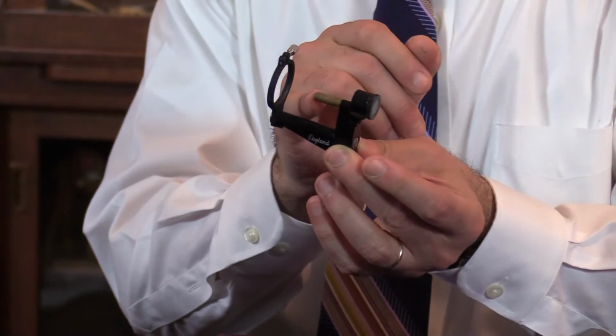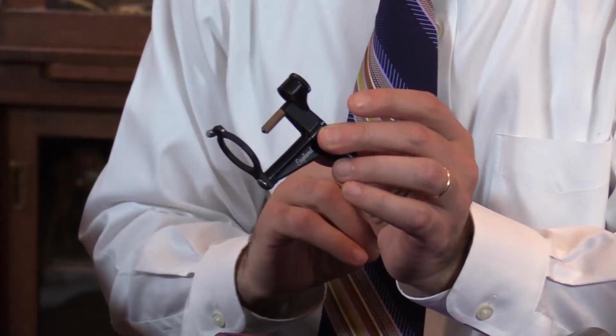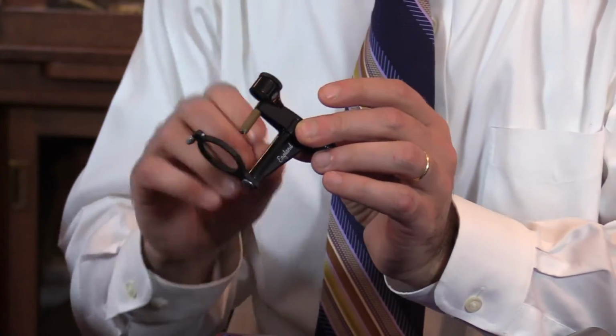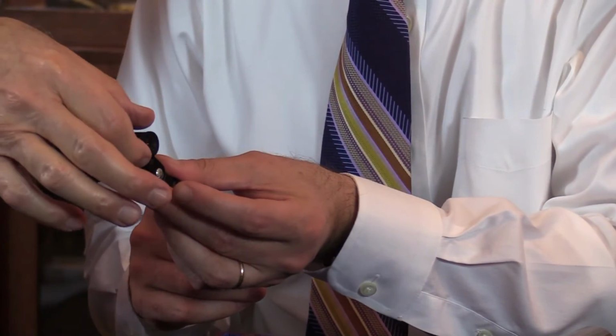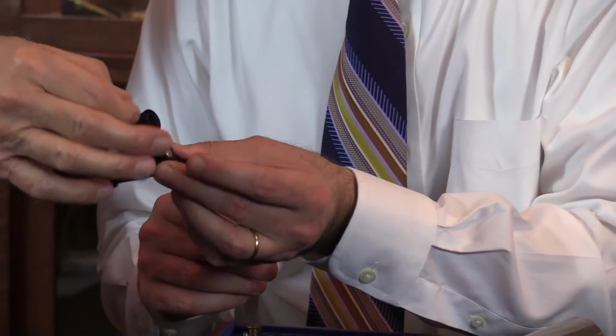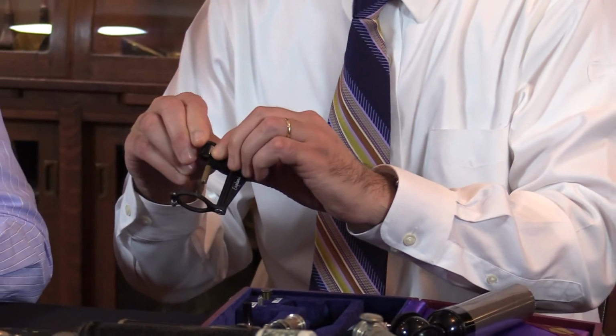And it's the bulb right here, and so we can use it to instrument the ear if we need to. I think this scope is to focus the light, right? Yes, you can turn it to focus.